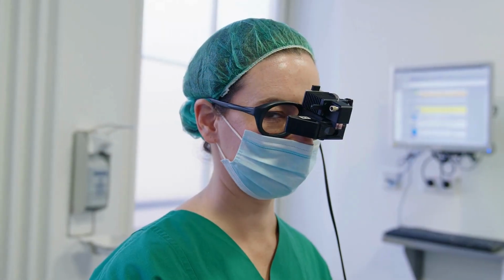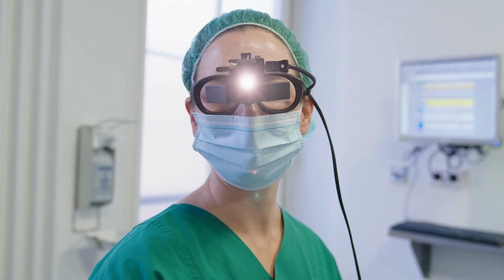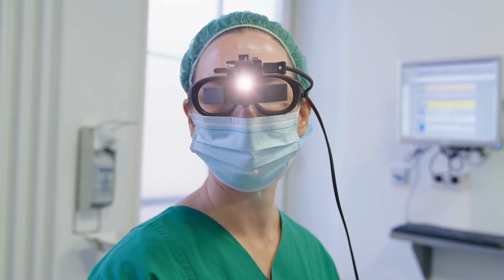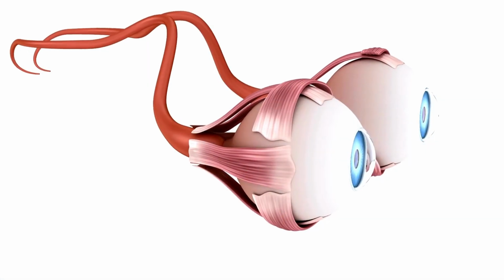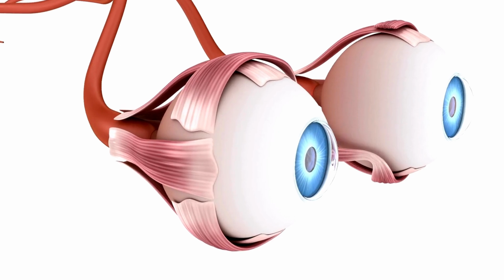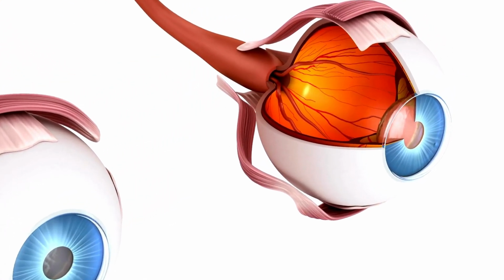YAG laser capsulotomy is a treatment for posterior capsule opacification. The ophthalmologist aims the laser to create a small opening in the cloudy posterior lens capsule, allowing light to shine through and restoring vision. Posterior capsule opacification is a side effect of cataract surgery.